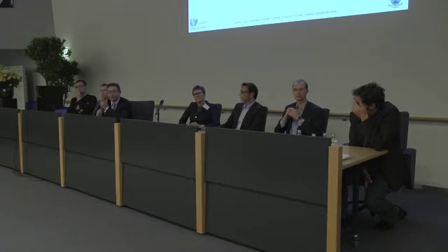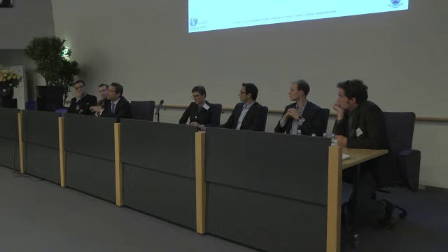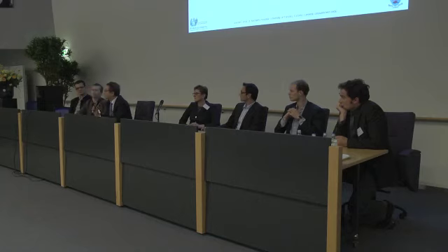Theo, and then a question at the back, and then we'll have to finish up. Just a very small comment: if you don't see an EDI, it can't be fatigue, because in fatigue you have a high EDI and no pressure development. And it can neither be ventilator-induced diaphragmatic dysfunction, because there you have a problem in the contractile machinery, not in the signal coming from the brain to the muscle. So if you don't have EDI, it is either heavy sedation or another problem, not a real problem of ventilator-induced diaphragmatic dysfunction.